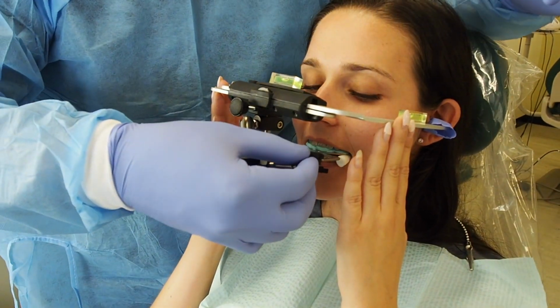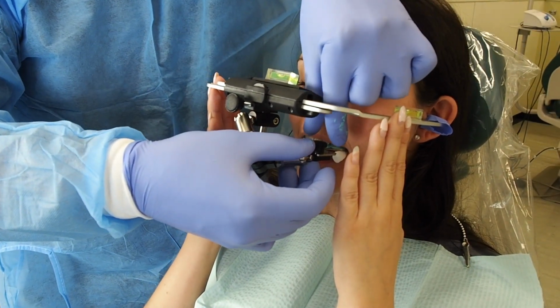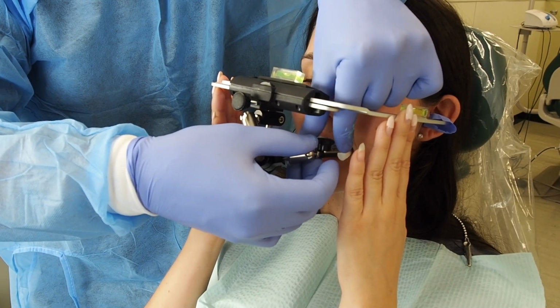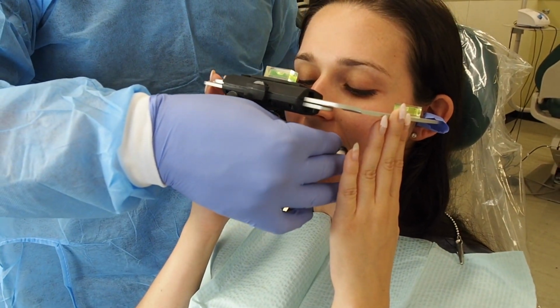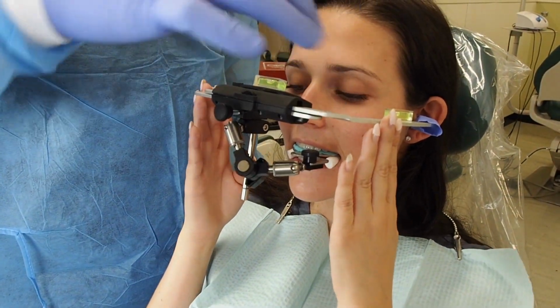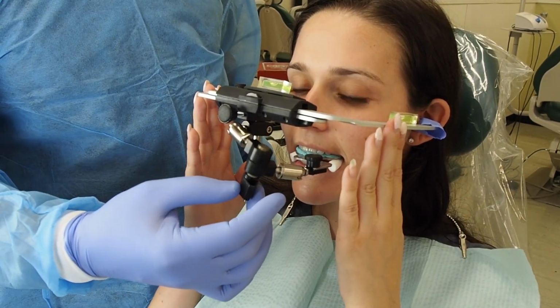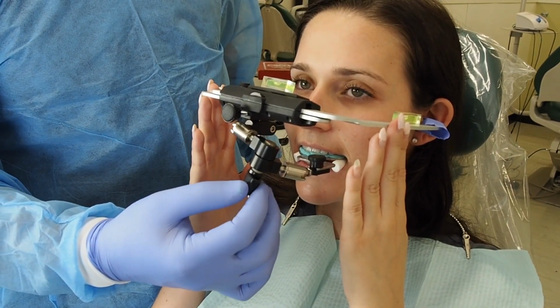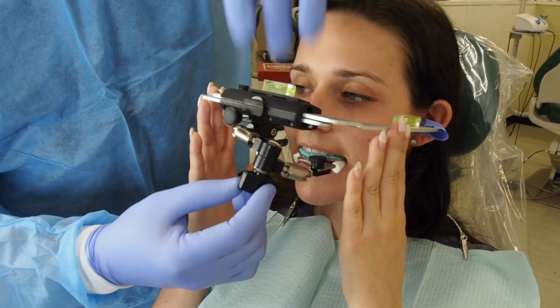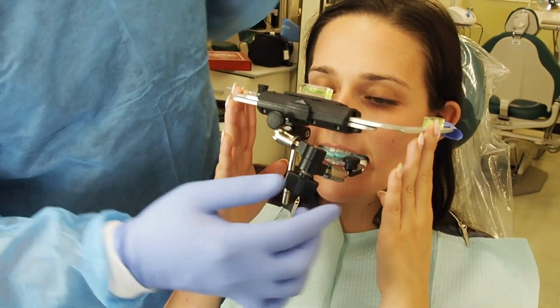The knob needs to be facing up, making sure it's right there. And now you can just turn it and secure it. Now I have connected the Facebow with the fork, and now the last thing that I need to do is make a tight connection between these two features, right? How do I do it? Just by turning this knob there.